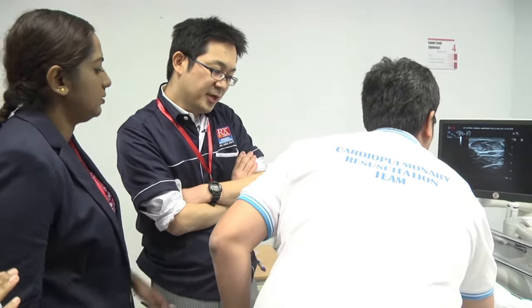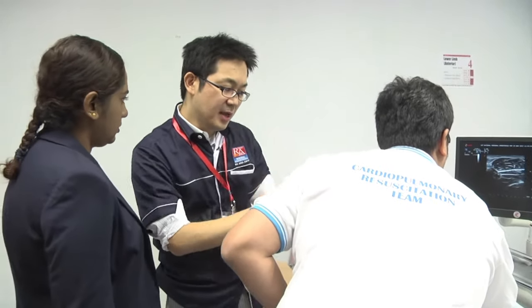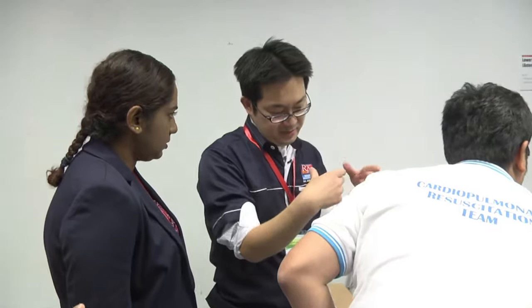Actually, we are not sure where some branches come from the main nerve. So yeah, we can trace the spread of local anesthetics, but we can't predict the effect.